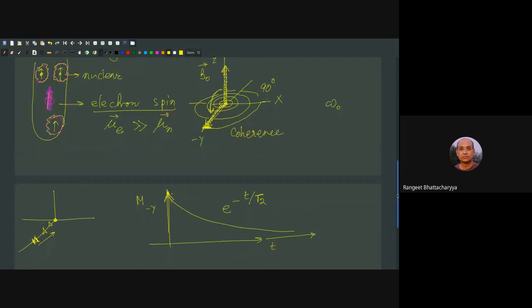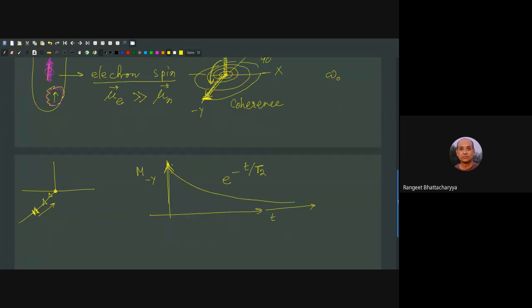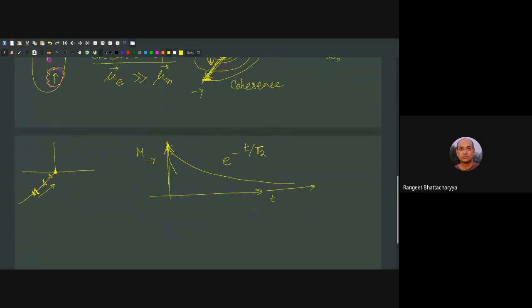All right. If you have paramagnetic spins there, and the nuclei are being affected by the magnetic field of that paramagnetic ion, the electron spin, then they will decay much faster. This is with paramagnetic ion, and this one without.